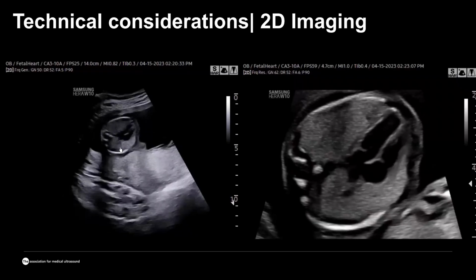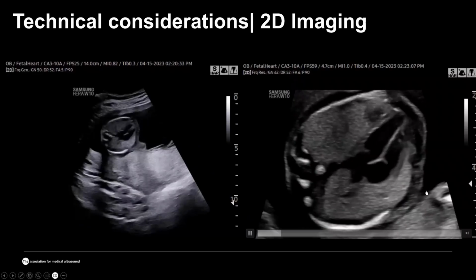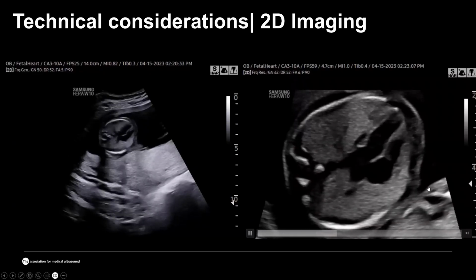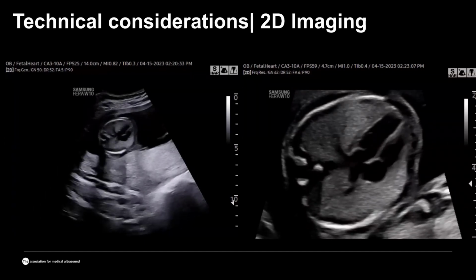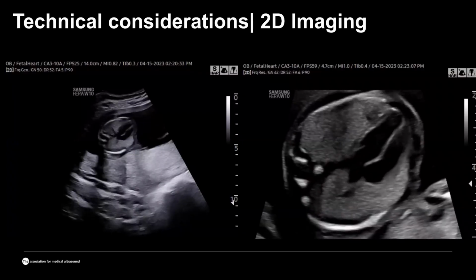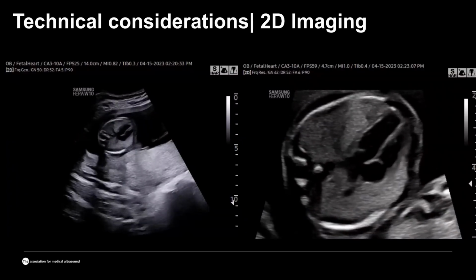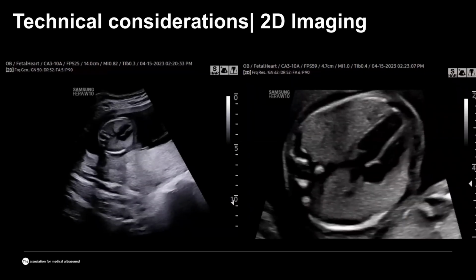We are moving from this image, where the structures are very small, to this image where the area of interest, which is the fetal heart and the fetal chest, takes the majority of the screen. Here we can see the highest resolution possible, including the axial and temporal resolution, of the structures that we need to look at.